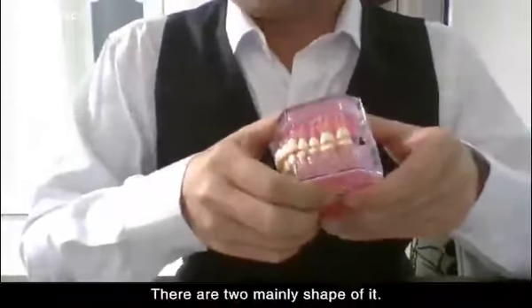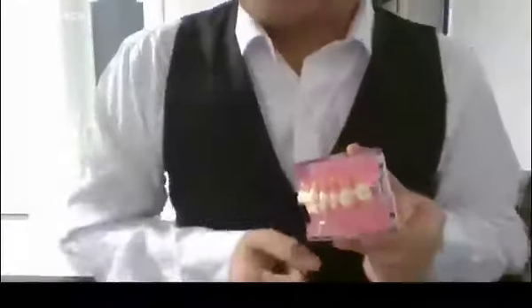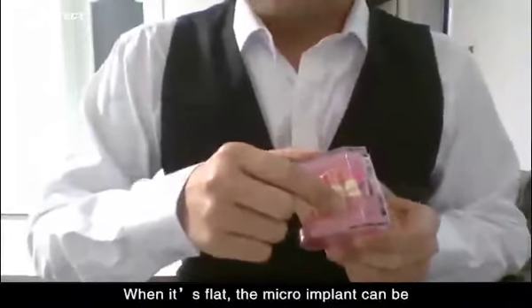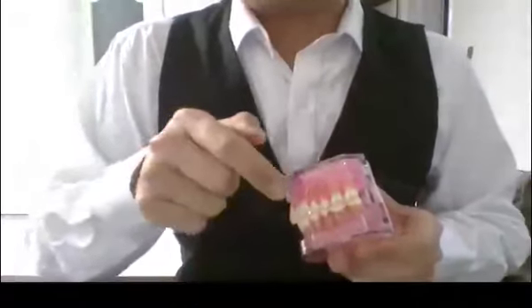There are two main shapes of it. The one is flat, the other is steep. When it's flat, the micro-implant can be inserted with a straight hand driver directly.